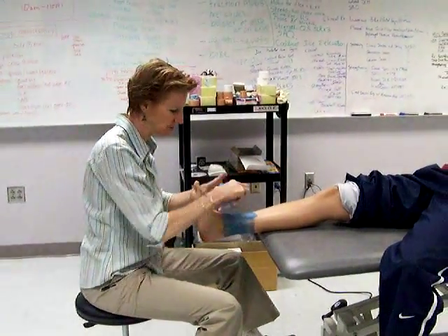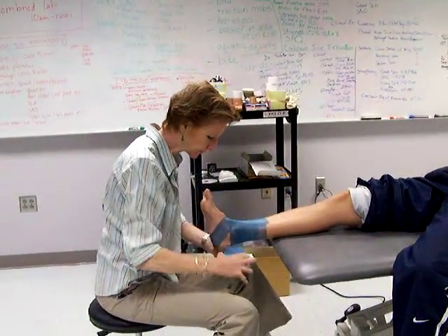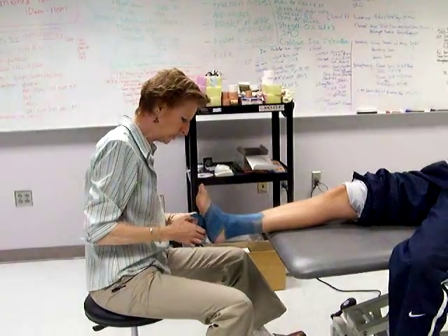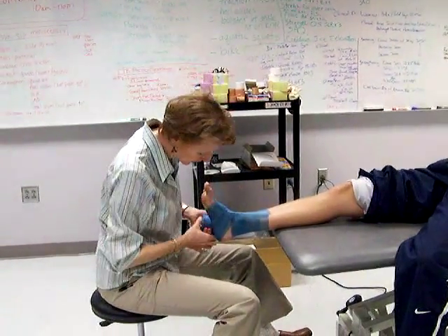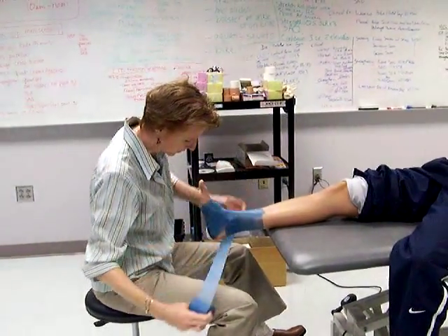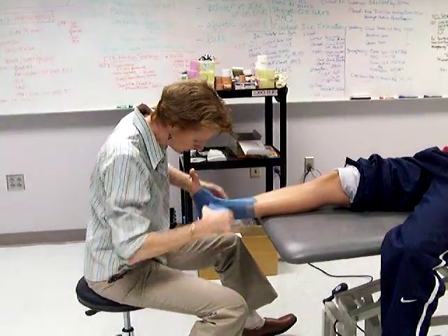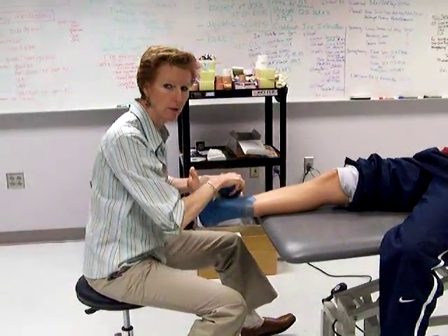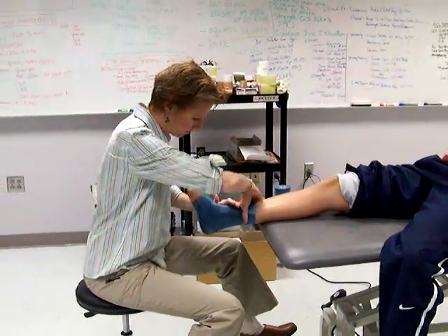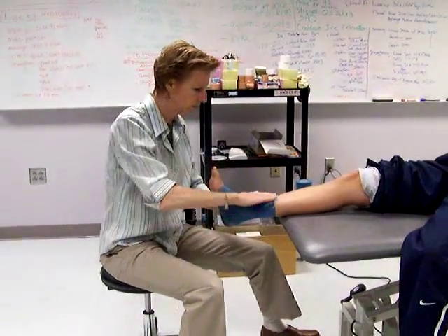You can apply pre-wrap circumferentially — it's just sponge wrap. You could put it on in a figure eight; it doesn't matter if you start from the bottom. This is pre-wrapped — you just put it on. Obviously this is to prevent blisters. Follow your angles. If you get wrinkles in the pre-wrap, that could cause blisters, so you want it on pretty smooth.